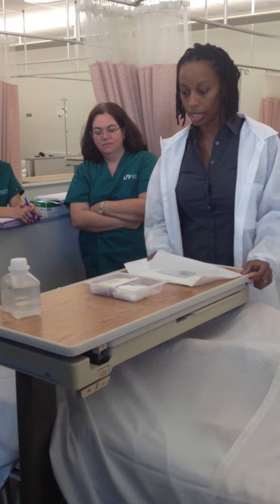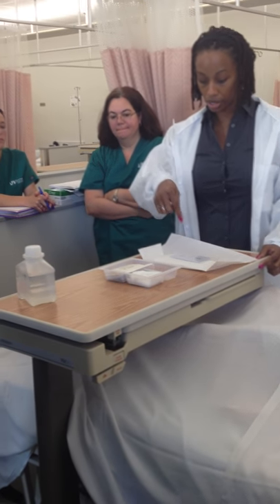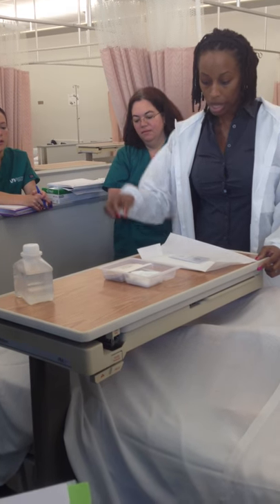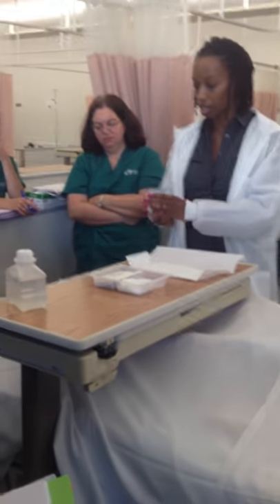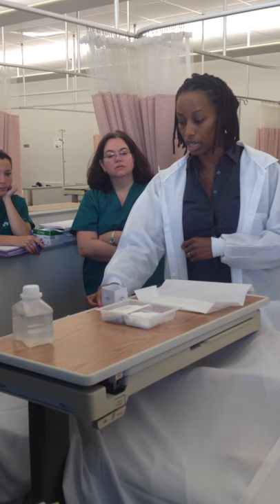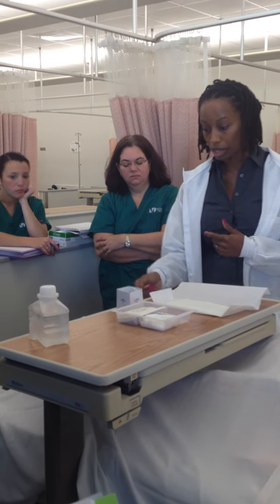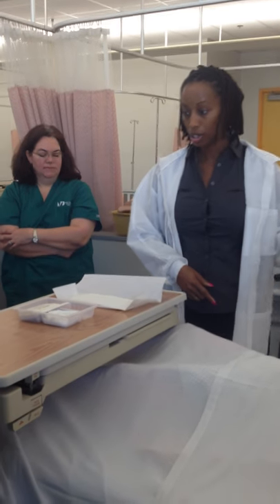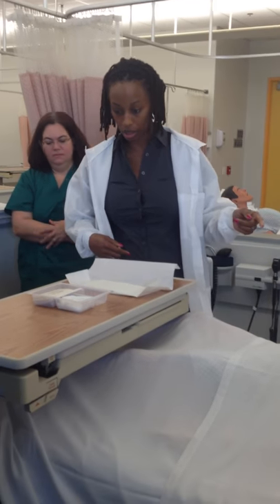When you first open your kits, your gloves are on top, and this is on top even on your suction catheter kit. You can just take it and pop it open — this is so that you can either pour the saline yourself, or if you put on sterile gloves, your helper could pour saline in there for you. I'm going to put it over here since I'm going to be suctioning on this side. You can pre-fill that yourself with the saline.